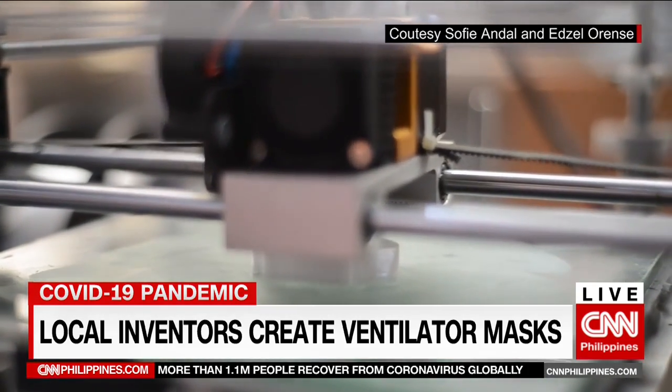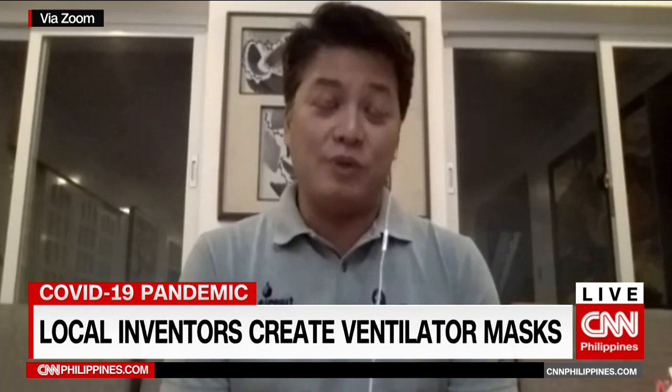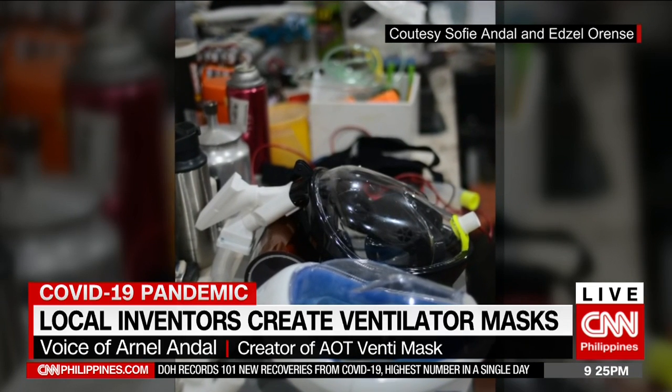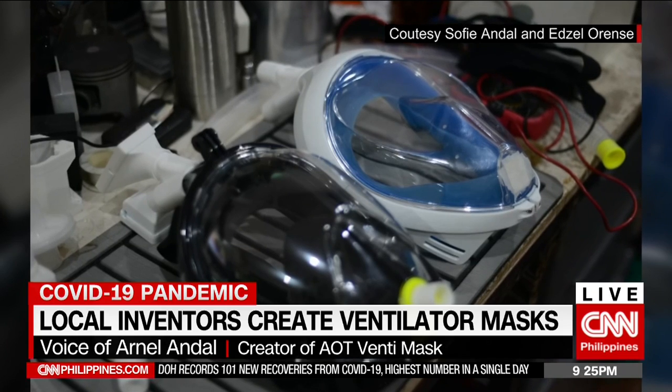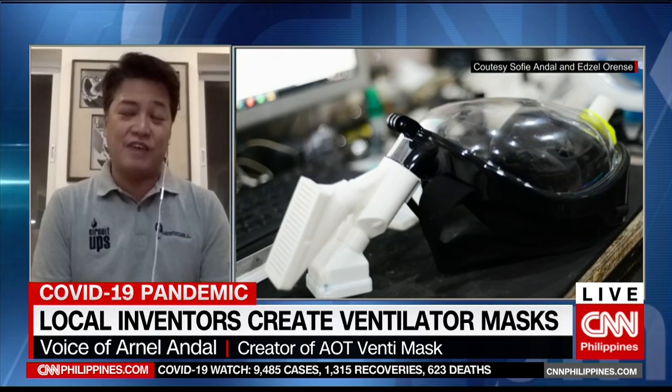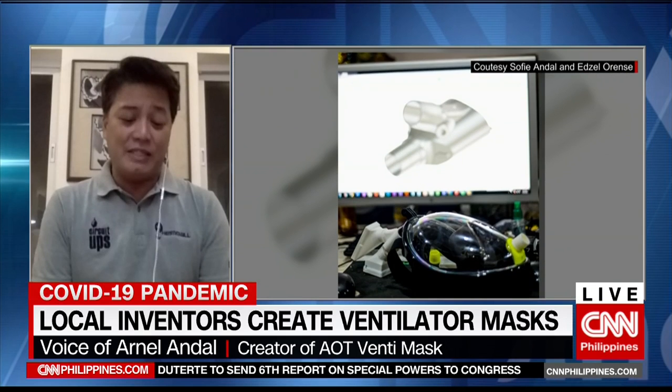So it is indeed a family affair, Arnel. What makes this VentiMask unique, and does it work across all ventilators currently being used here in Philippine hospitals? We work with the guidance of Dr. Chris Tan of PJH. This mask acts as a non-invasive ventilation interface that allows the patient not to be intubated for as long as possible. Intubated patients need to be sedated, and that lowers their chances of survival significantly. With this VentiMask, we hope to help exponentially increase their chances of survival pre-intubation.